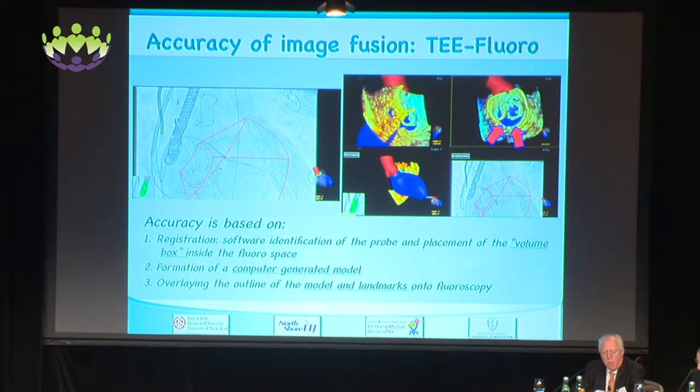But what about CT and fluoro and echo? That's real time. Now we can say that is more reliable. Well, let me beg to disagree with that, because it depends on how these images are registered.